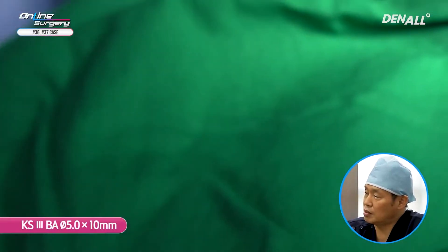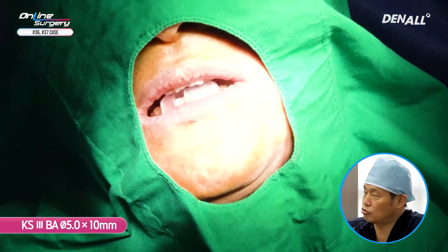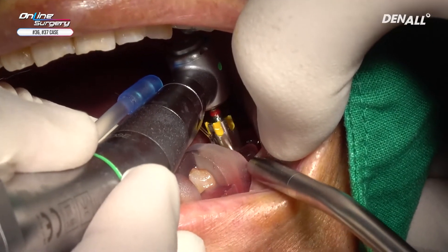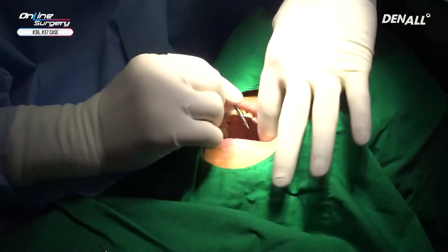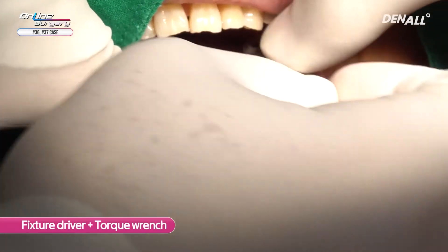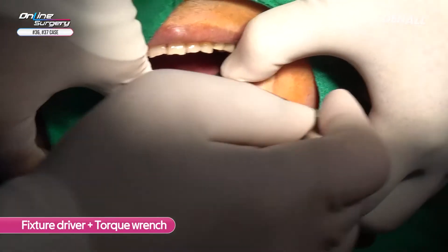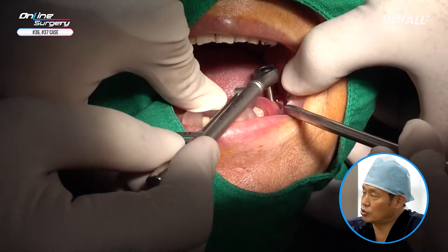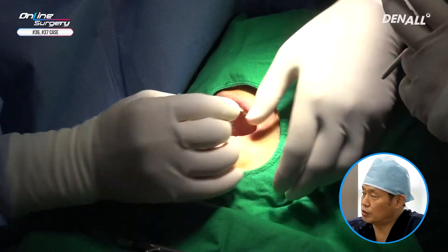KS3 BA surface 5.0 by 10 mm implant has been prepared. BA is a hydrophilic implant, and before you place it you need to irrigate it sufficiently to reduce the possibility of infection. The patient has had chronic periodontitis for quite a while and the alveolar bone is quite hard. Final torque is sufficient. I have placed the implant in number 36.